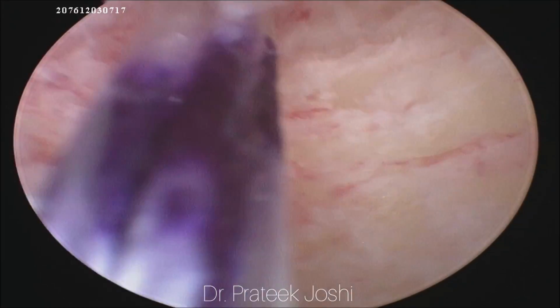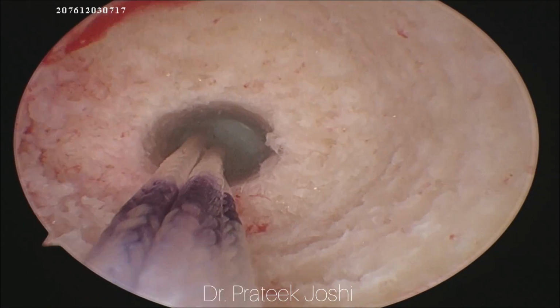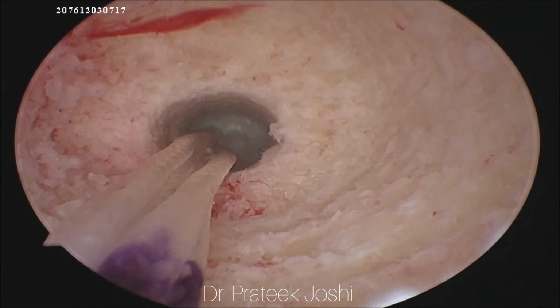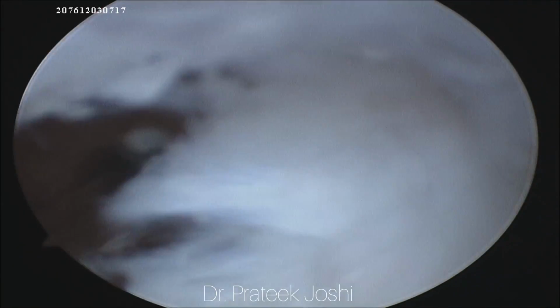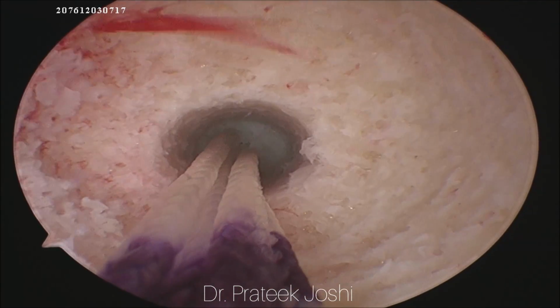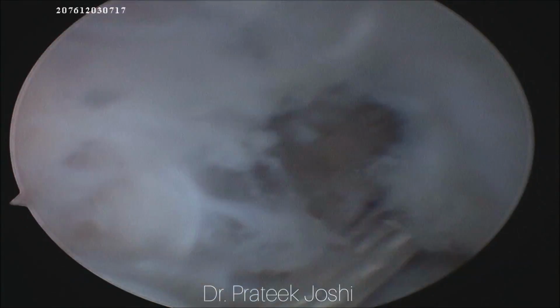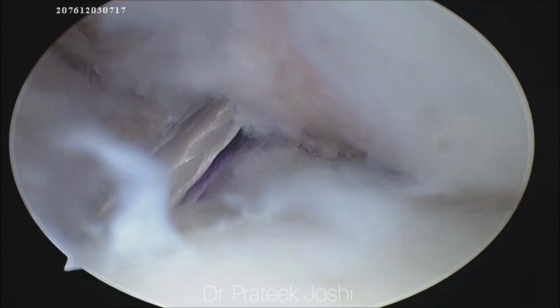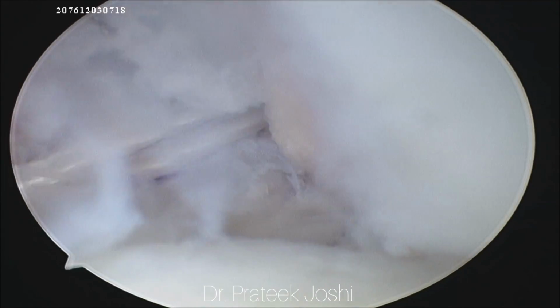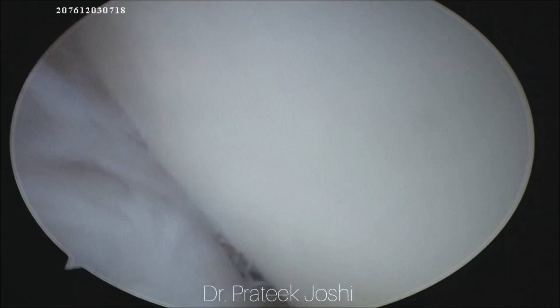This is the view from the ACL femoral tunnel once the button is flipped. You can clearly see that it is perfectly flipped on the lateral cortex of the femoral condyle. And now we are going to gently pull the graft from the tibial tunnel to the femoral tunnel as we pull the threads attached to the adjustable loop endo button. And as you can see, now we are pulling the ACL graft from the tibial tunnel to the femoral tunnel.